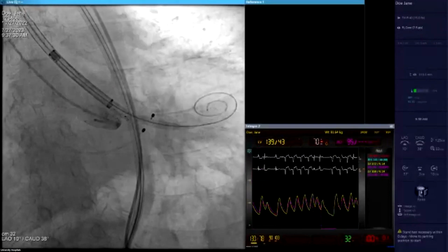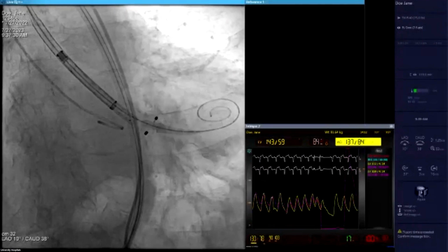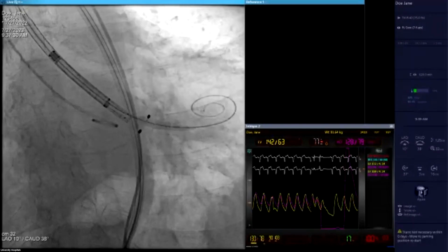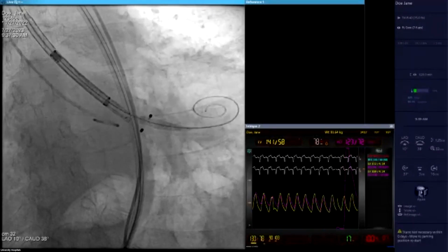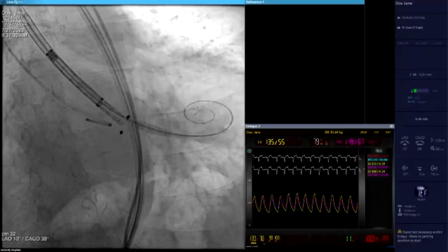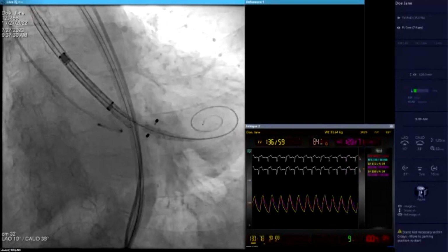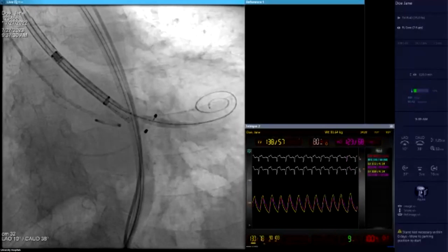Good. Coming slow. At this point, we're coming very slow. Very slow. Rotating the catheter very slow. There's no rush. Let the nitinol come, the tension from the catheter come off gently, right? No rush. We're going slow.